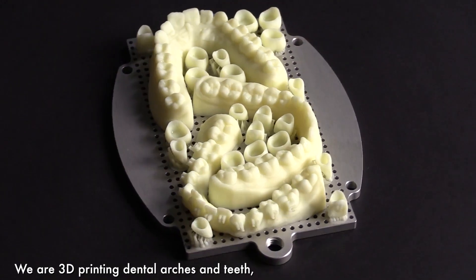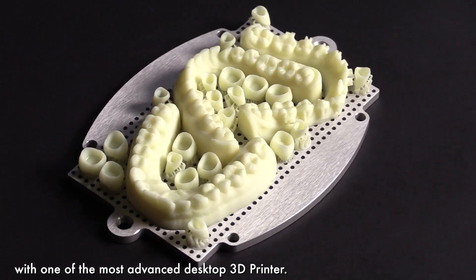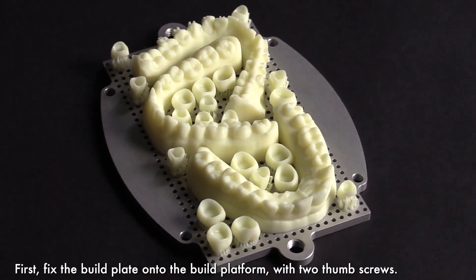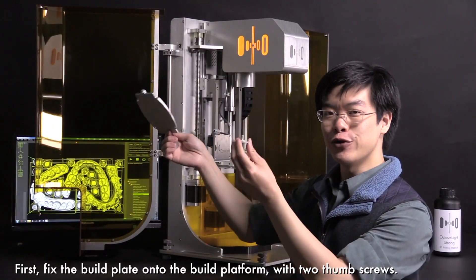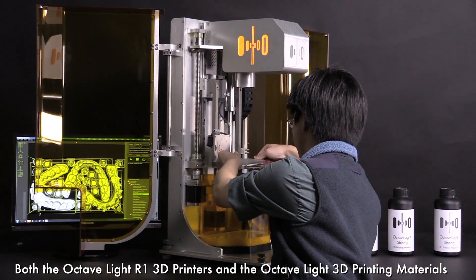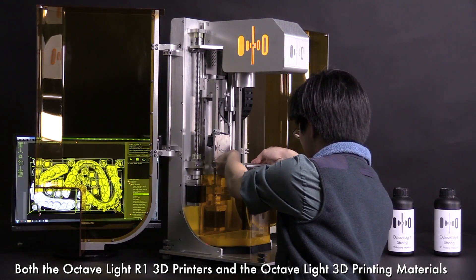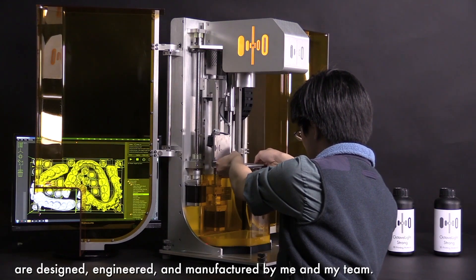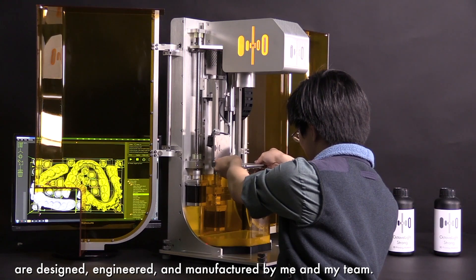We are 3D printing dental arches and teeth with one of the most advanced desktop 3D printers. Fix the build plate onto the build platform with two thumb screws. I'm Charles Lowe. Both the Octavlite R1 3D printers and the Octavlite 3D printing materials are designed, engineered and manufactured by me and my team.